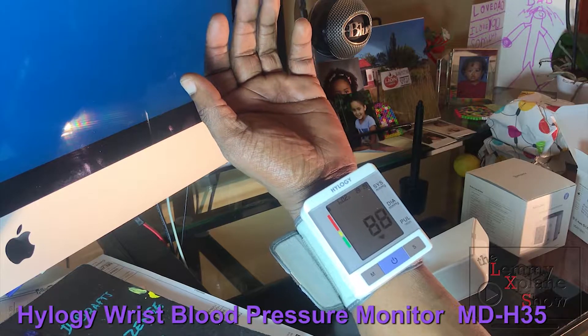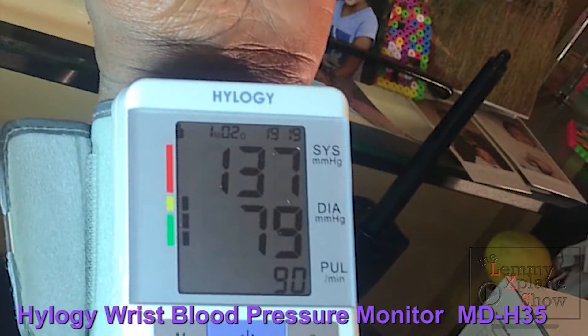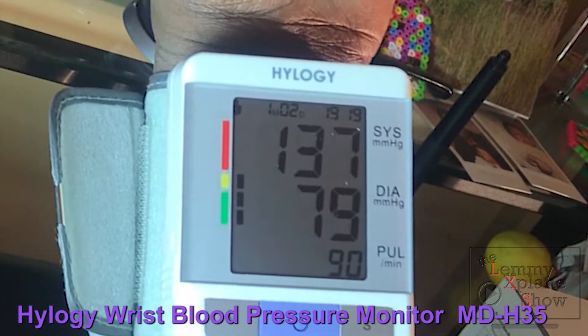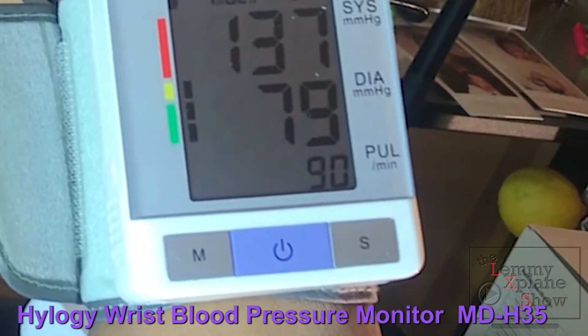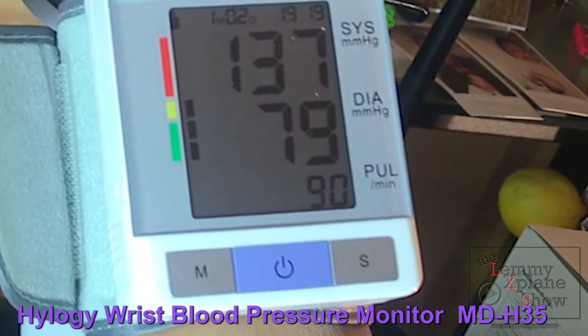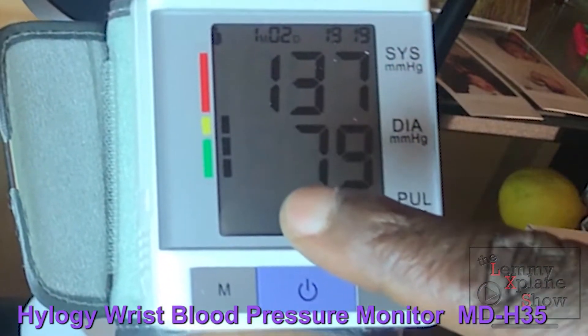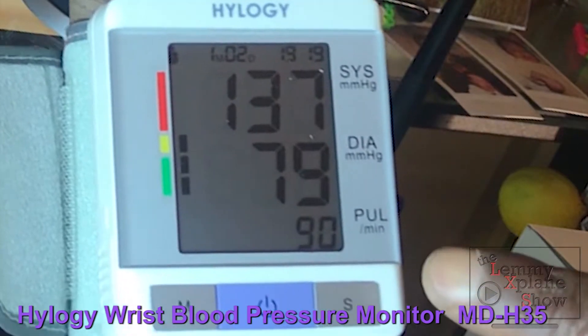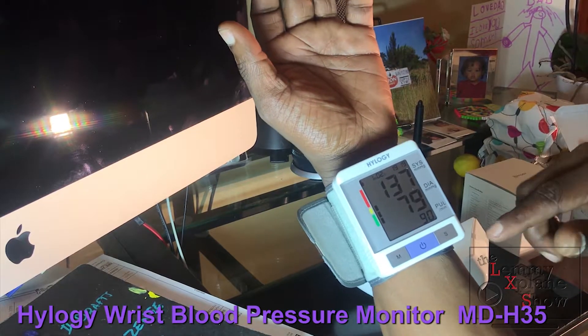It's now calibrating my blood pressure — I'm at 79, which isn't bad, and my pulse is 90 beats per minute. It's showing me I'm in the orange range, but I think my pulse is rather high because I'm talking and a bit excited about doing this review.